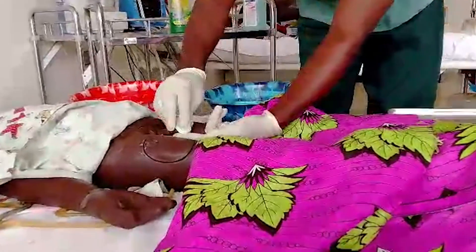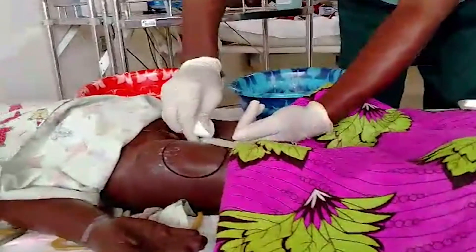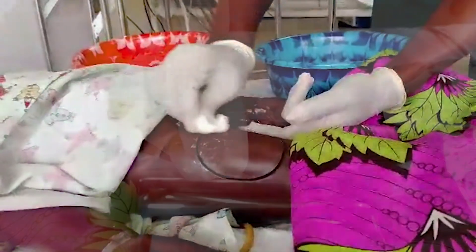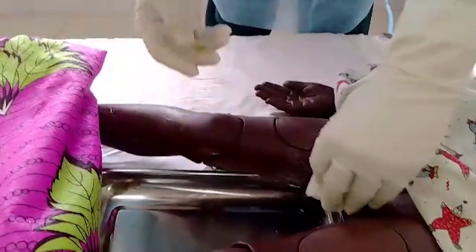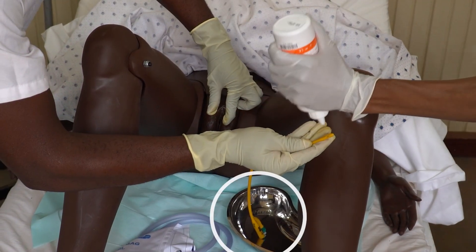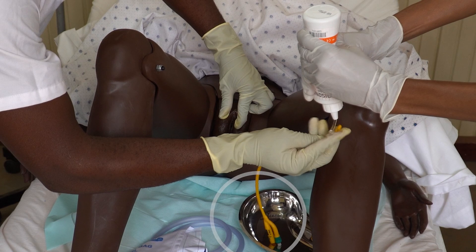For male patients, with the non-dominant hand, lift the penis at a 60 to 90 degree angle and retract the foreskin. This hand will remain here throughout the rest of the procedure. Using a non-touch technique, use the dominant hand to disinfect the insertion site with the appropriate aseptic and sterile gauze. If available, use sterile forceps. Place the end of the catheter inside the sterile kidney dish and place the sterile kidney dish between the patient's legs.